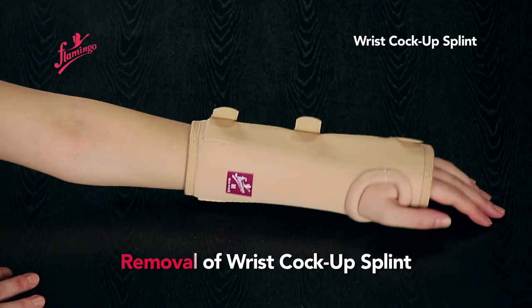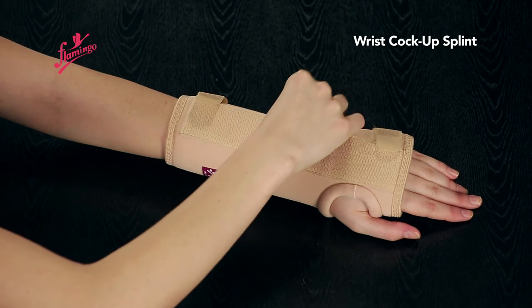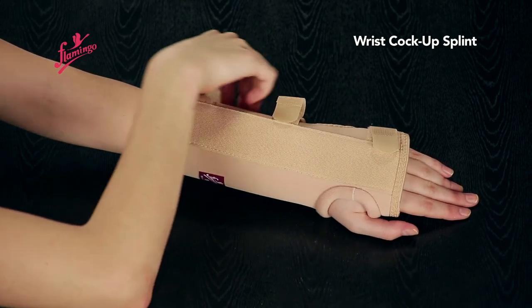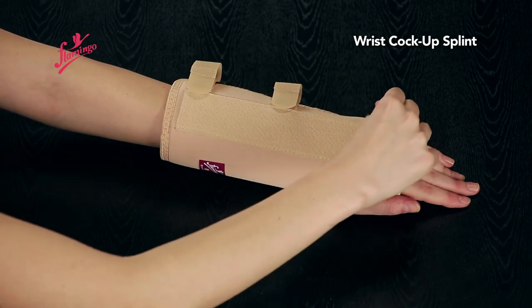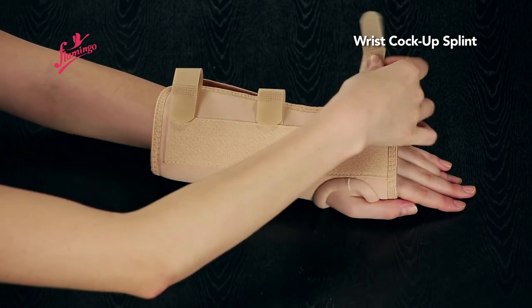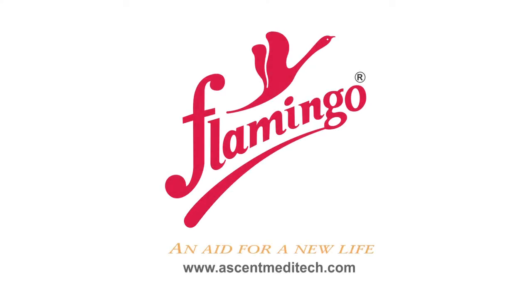Removal of wrist cock-up splint: open the velcros and remove the wrist cock-up splint.